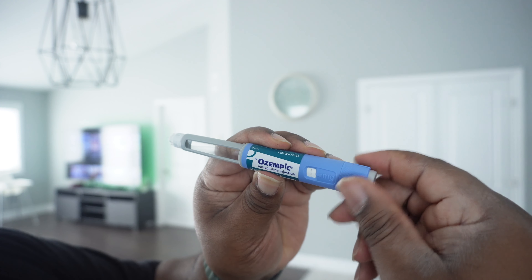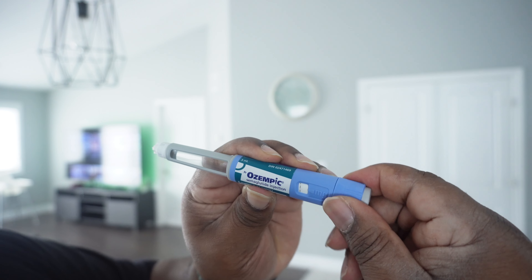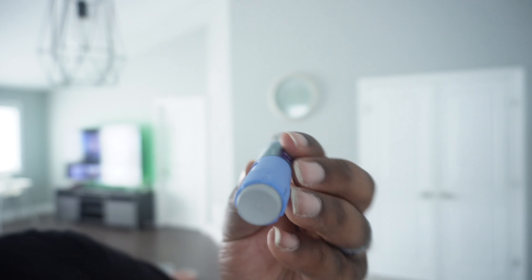Next I'm going to dial this up to one milligram. There — I'm at one. Now I'll prep the area where I'm going to inject. You can do it at your shoulders, stomach, or thighs. I've tried it in my arm and in my stomach. When I did it in my arm, I felt like I couldn't tell if the medication was working. When I moved to the stomach, I actually had results. Today I'm going to inject in my stomach, so I have an alcohol pad here to clean the area.